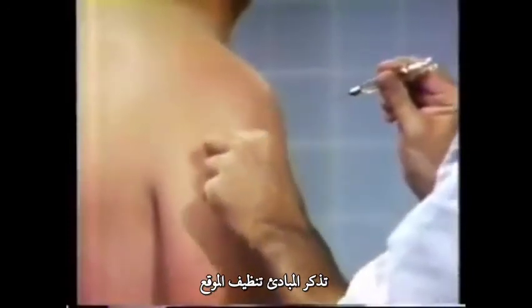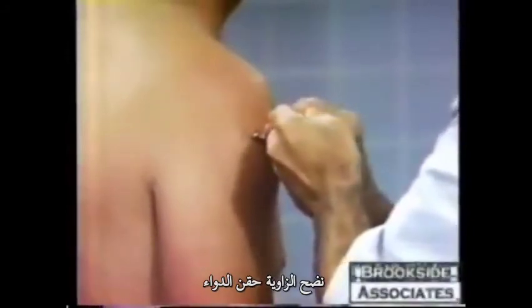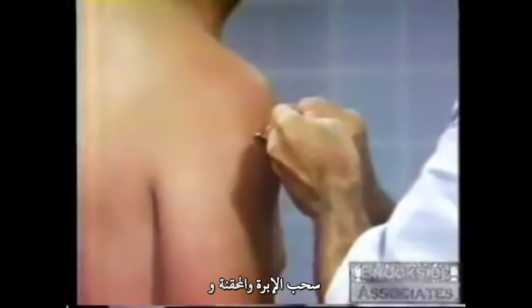Clean the site, firm the tissues, inject at a 90-degree angle, aspirate, inject the medication, withdraw the needle and syringe, and massage.